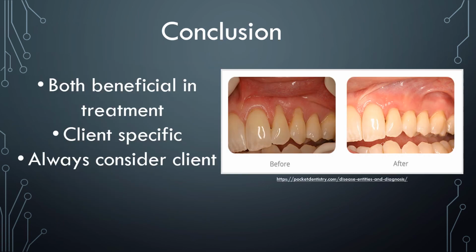In conclusion, digital radiography and CBCT, combined with assessment of clinical probing depth, attachment levels, and alveolar bone levels, may increase the ability to determine the treatment outcome following periodontal therapy.